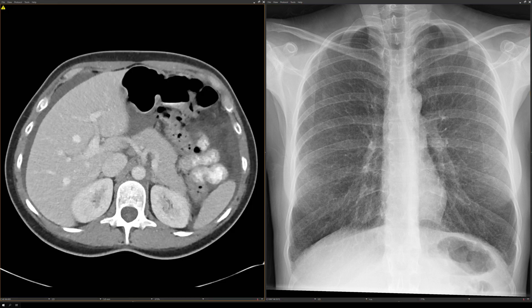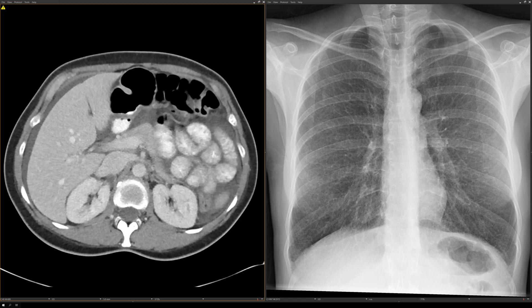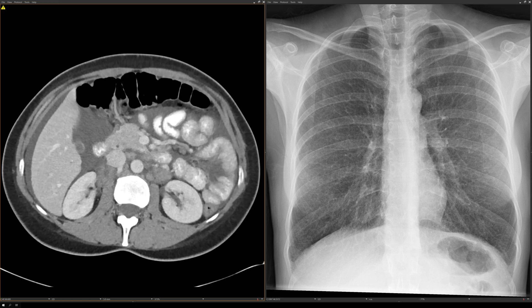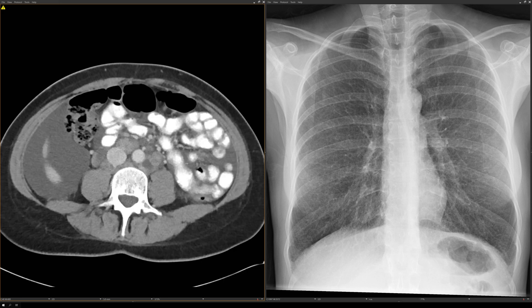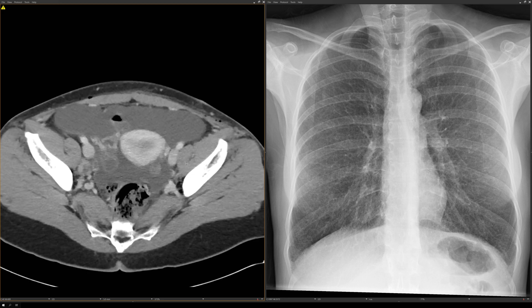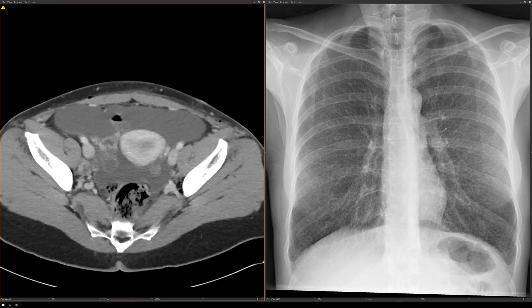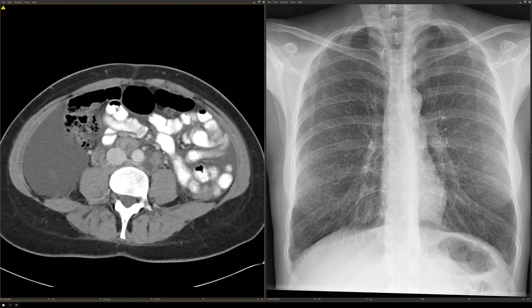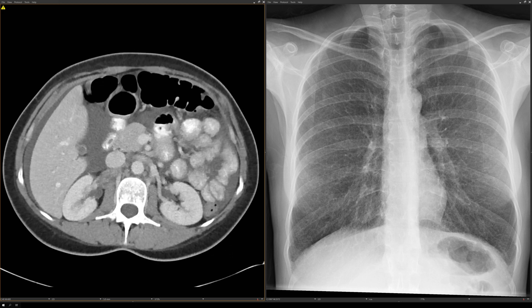On CT, this patient has an additional finding: ascites. Remember that these patients can have chylous pleural effusions as well as chylous ascites. Looking at the retroperitoneum, this patient also has low-density lesions consistent with lymphangioliomyomas. Remember, chylous effusions — either pleural or ascites — will usually just look like simple pleural fluid; it's rare that you'll see macroscopic fat in the pleural effusions or in the ascites.